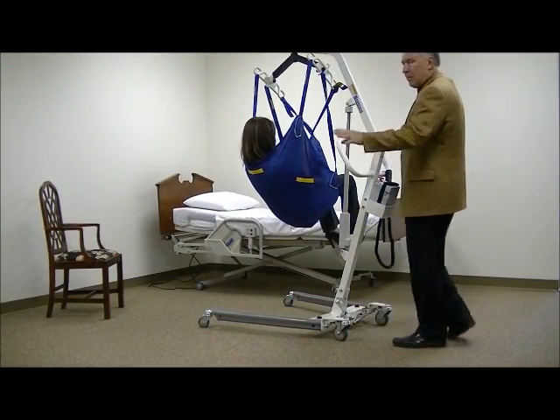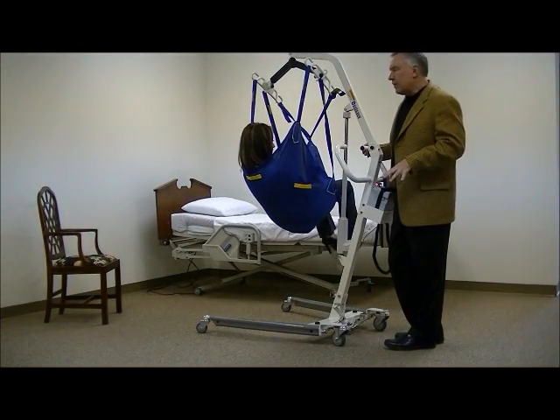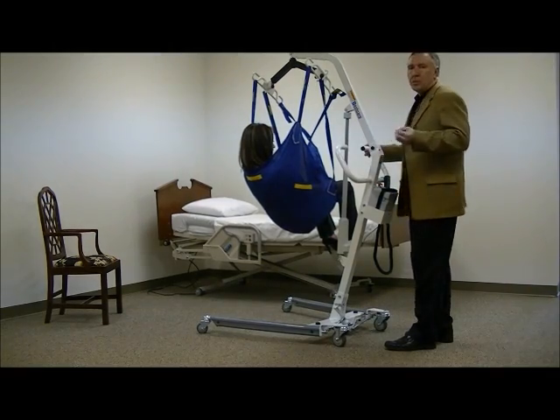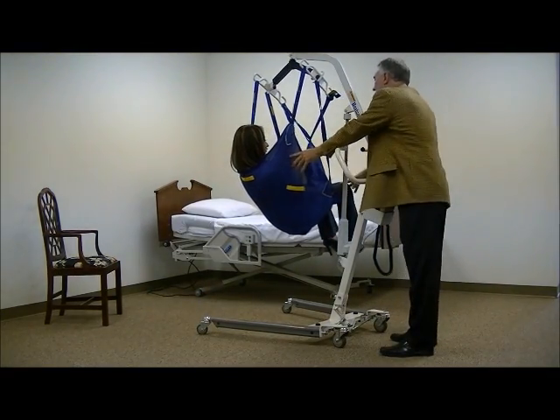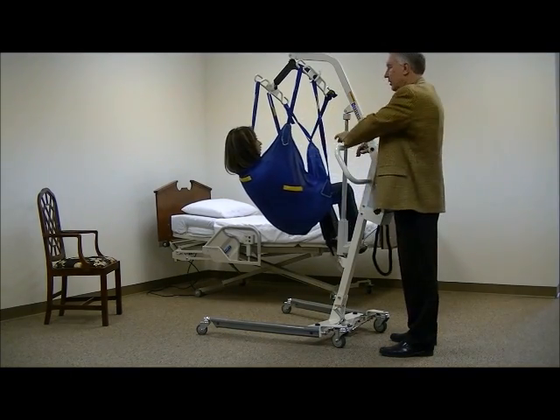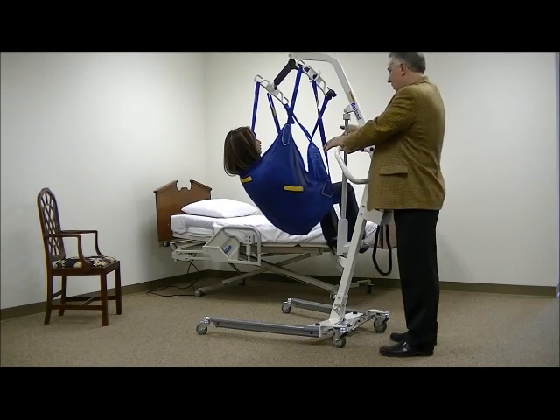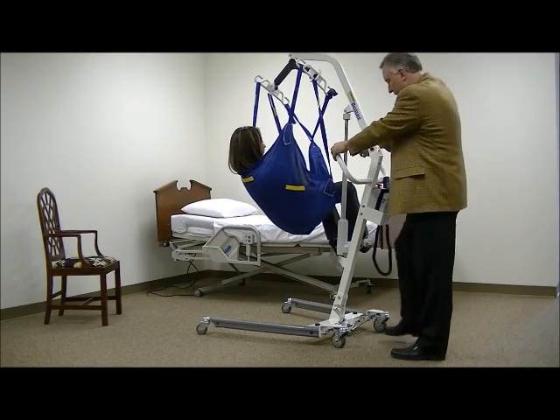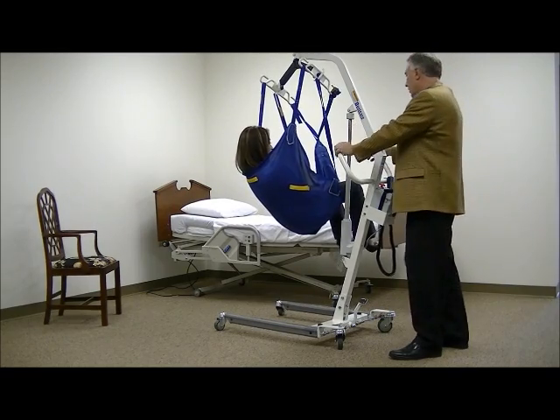The lift is always going to be more stable with the base opened. But it is okay to close the base on the lift. What causes potential tipping issues with any kind of lift is when the center weight goes outside of the legs. You always want to keep your weight centered over the spreader bar in the middle of the lift for the transfers. So it's safe for you to do that as long as you close the legs, as long as you pay attention to where the patient is.